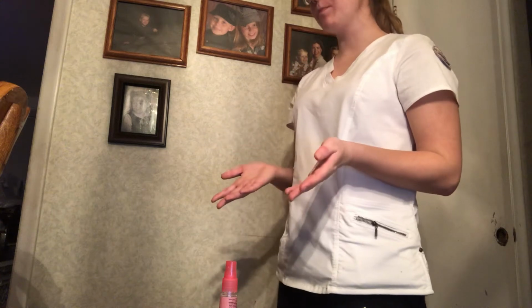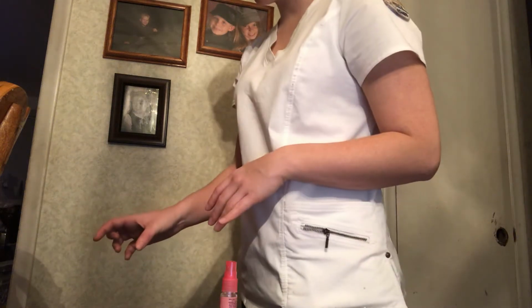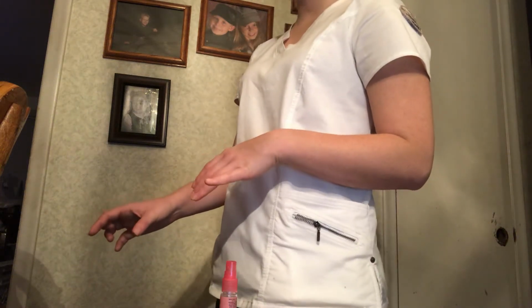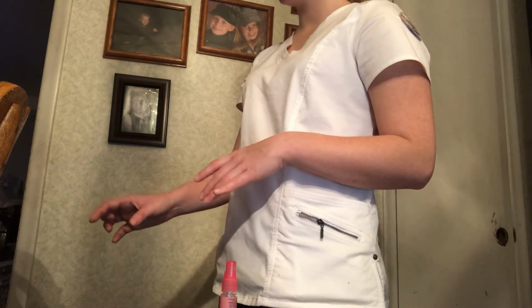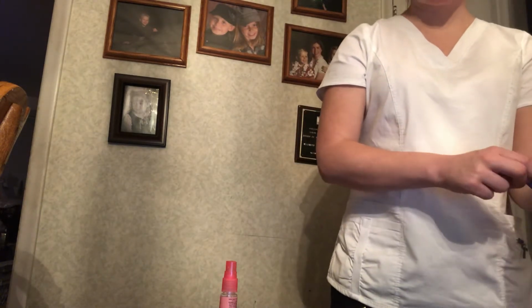Hi, my name is Julie, and today I'm going to be doing your insulin injection. Can you just tell me your name and date of birth? Okay, I'm checking your wristband. Okay, great. Do you have any allergies? Okay, so now I'm going to close the curtains for privacy, and then I'm going to conduct hand hygiene and then put on a pair of clean gloves.